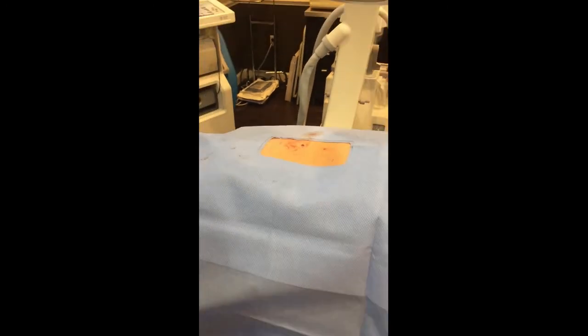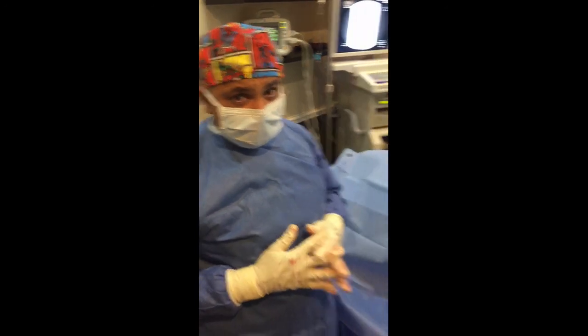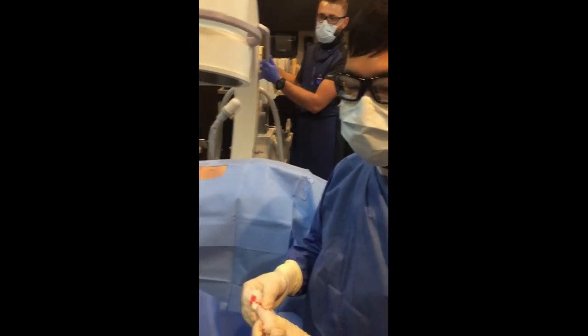So we're going to go ahead and dress this incision today, and she will basically be limited to sponge bathing for a week. Okay, sweetie? And we'll come back in and we'll remove this dressing, and hopefully she'll feel a lot better from her back pain. So thank you again, and I want to thank Dr. Chen, who was of assistance to us for our kyphoplasty.